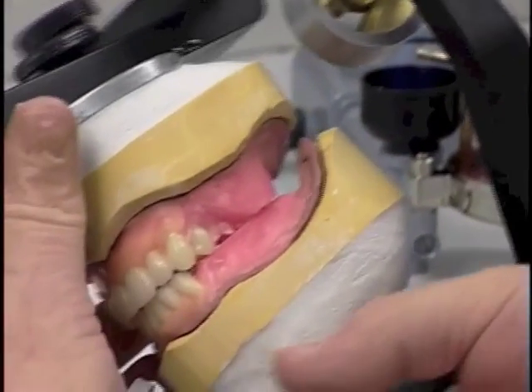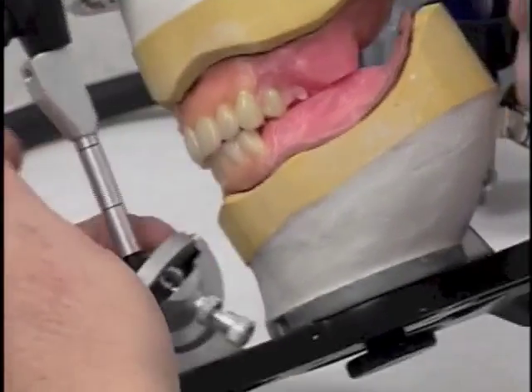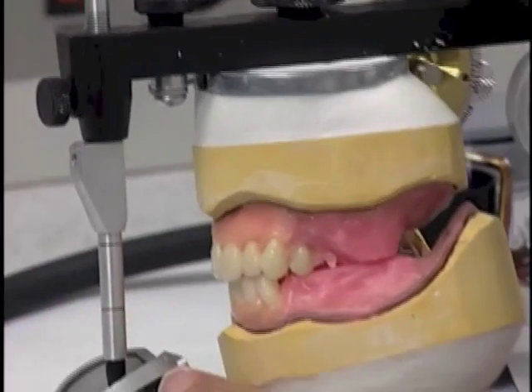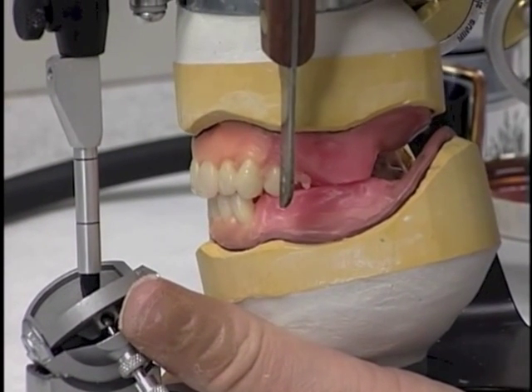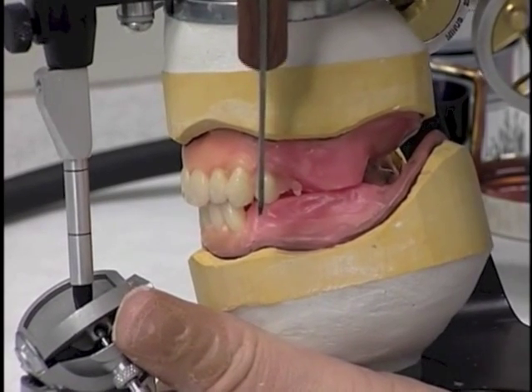Now its vertical height is much more compatible. It's about the same height vertically as the canine. Looking at it from a straight side view like this, we would like the long axis of that premolar to be perfectly vertical, and it appears to be at this point.